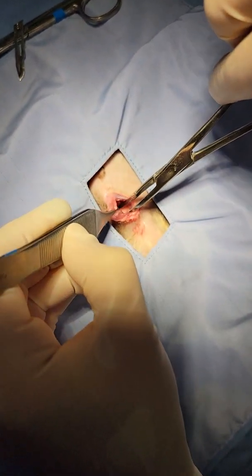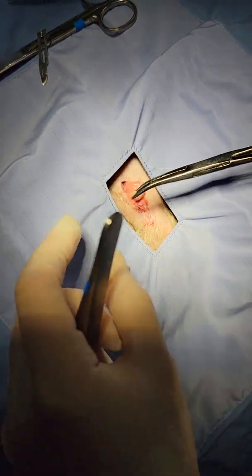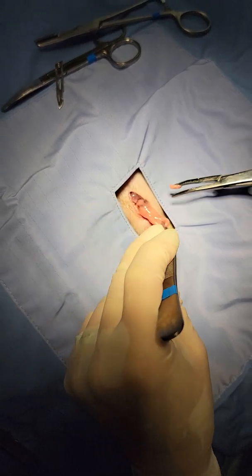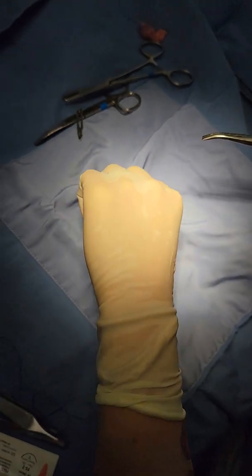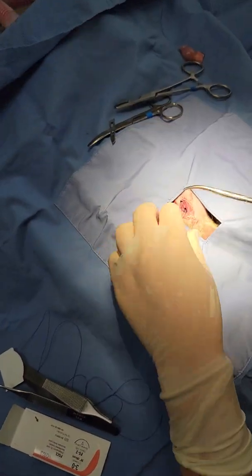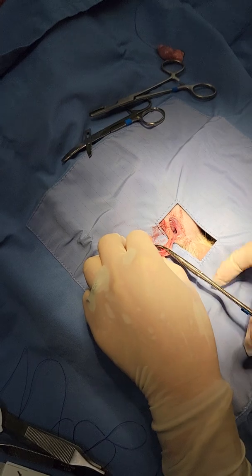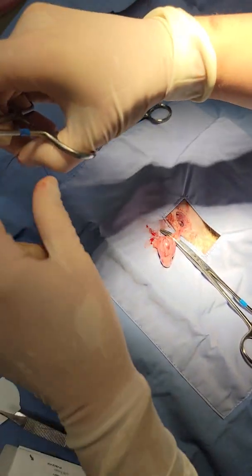It's a very distinctive fat color. I think I can see it right there. I'm just going to grab it and exteriorize it. You do want to make sure that your incision on your body wall is big enough to allow your testicle to come out. So I got a little bit of bleeding here, but not too much. I'm going to go ahead and clamp here and do my two ligatures again.